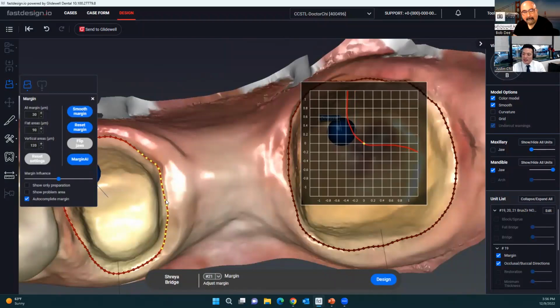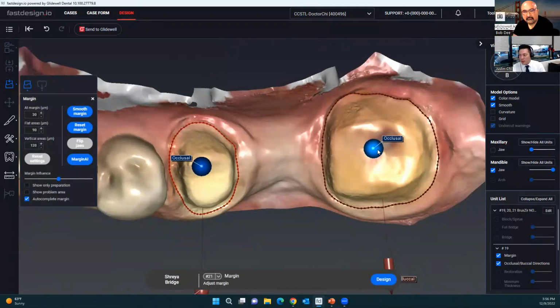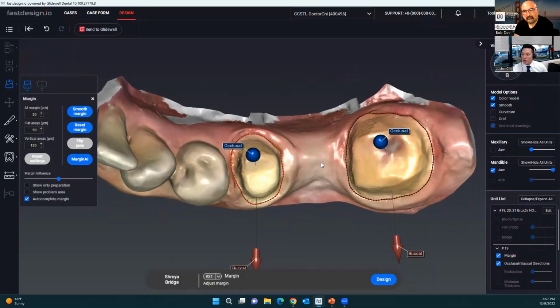Exactly, exactly. Now, there's nothing wrong with setting it up as 18, 19, 20, and the AI would create a molar. It would put molar anatomy. It would just be really narrow, really small, dimensionally mesial distal. So not a huge deal, not something that our patient would really notice, but just looking at that restorative space, I thought premolar anatomy would work out a little bit better.